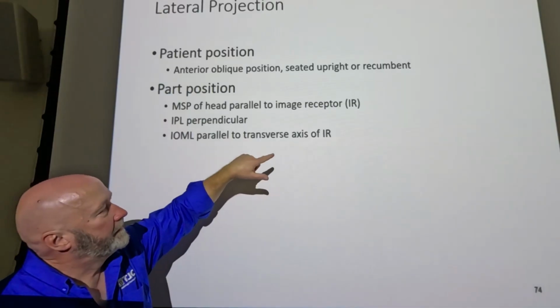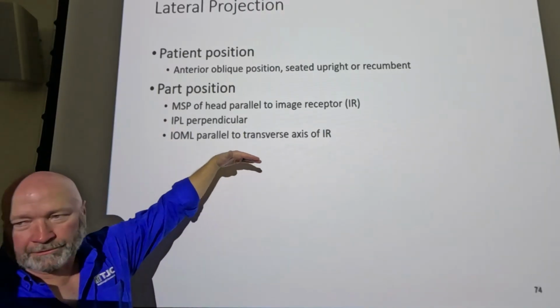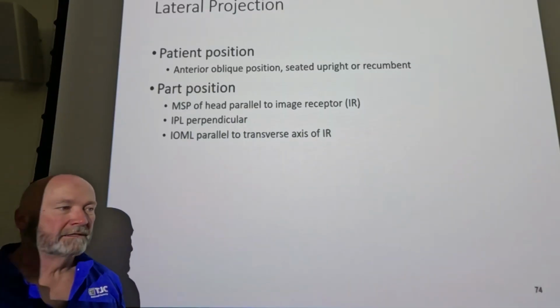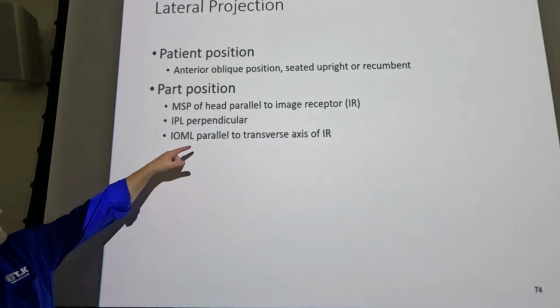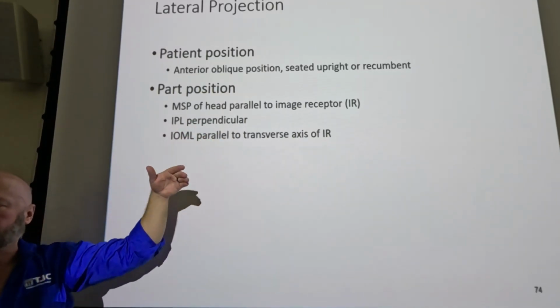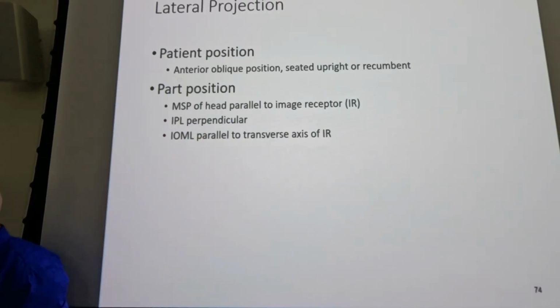The purpose of the uniformity is so that the radiologist, if you're reading a lot of skull x-rays, doesn't get one that looks like this, and the next one looks like this. It's just uniformity. Of the two, that's less important. That is very much important. That's going to determine whether or not the patient's rotated and whether or not you can see what you need to see. Certainly do this, but absolutely do that, okay?